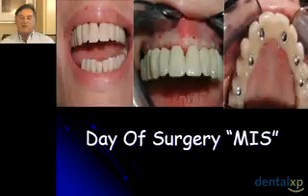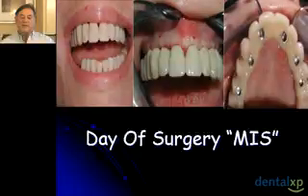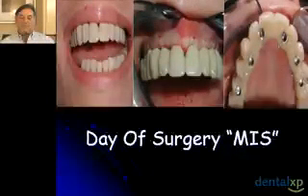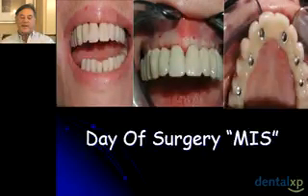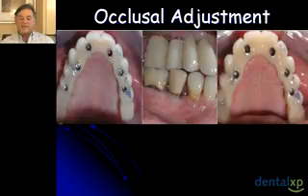You see the little puncture points in the vestibule. These were where the anchors were seating, and you have a screw-retained acrylic laboratory-made prosthesis on the day of the surgery. So we would call this a guided surgery or teeth in a day. Is it accurate? Well, it's accurate from two perspectives. It's accurate in where I position the implants following the planning, but it's also accurate in that the restoration is almost dead on right from the beginning.